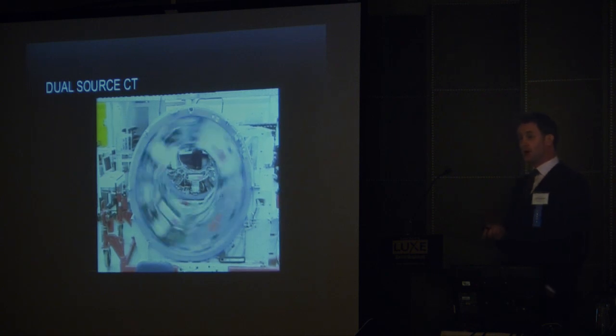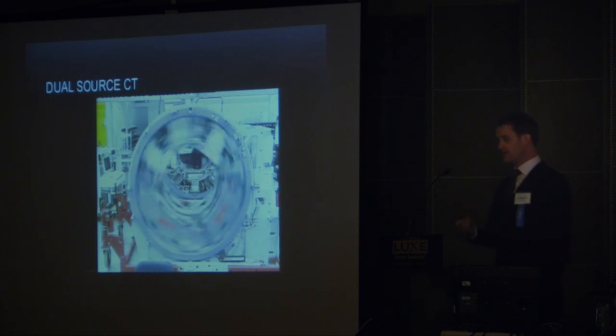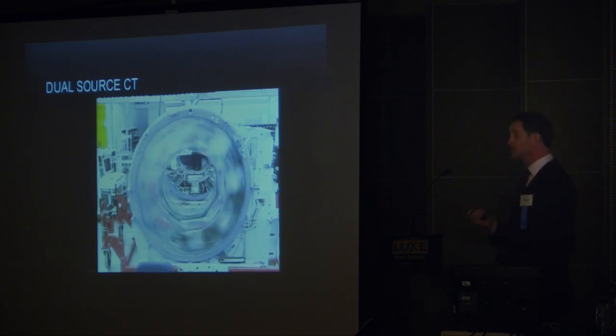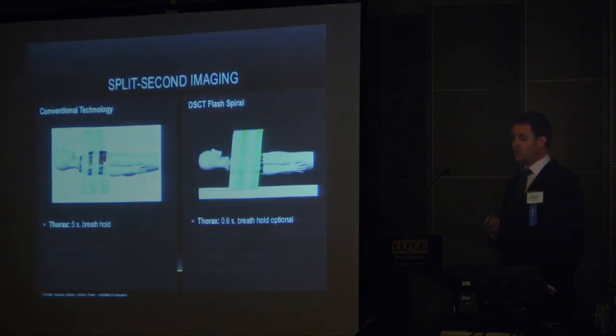And so these came on the market in 2006. They began to be refined in the US market 2007 and up to now, so that this is really what the state of the art is in CT technology at the moment. And doing that now, it's fancy engineering. What does that mean? It allows us to image a lot faster.